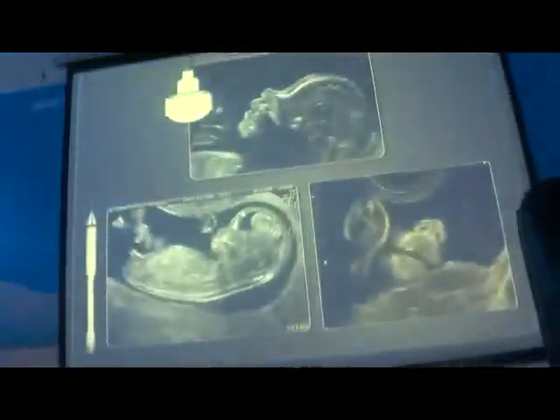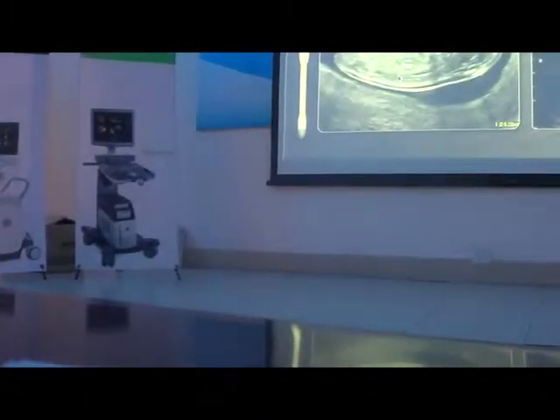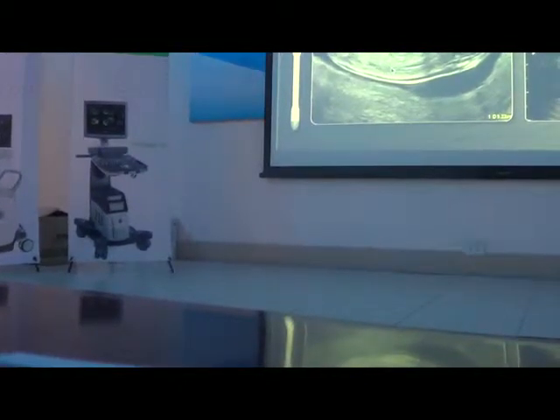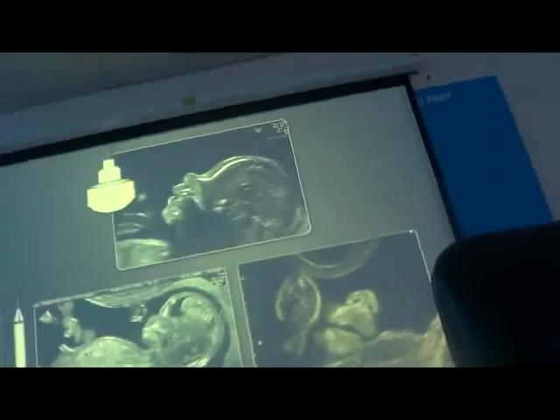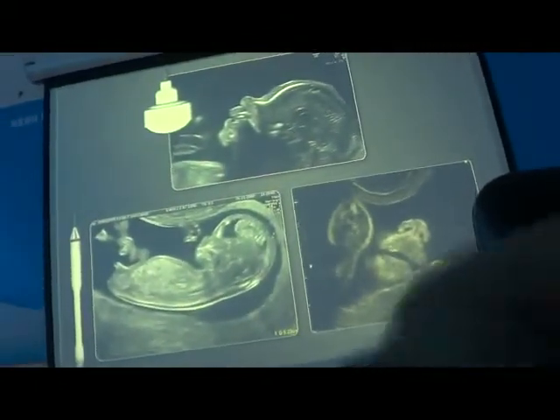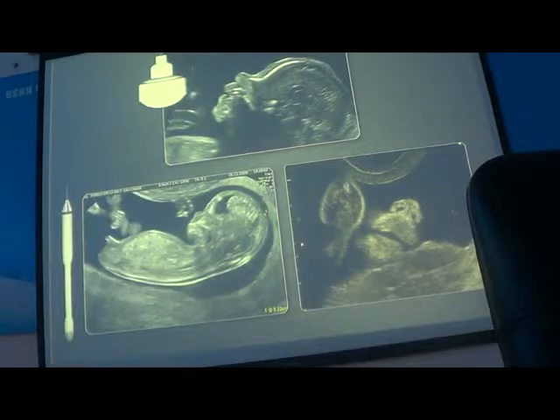But in the first trimester of the pregnancy, we can use a transvaginal probe, especially because we obtain a more precise picture. Tuy nhiên ở trong quý 1 thì đầu giò đường âm đạo bổ sung rất nhiều tính năng hiệu quả trong siêu âm thai quý 1. But sometimes in the second trimester, it's helpful to use a transvaginal probe when the head of the fetus is too low and the face is looking toward the back and the cervix.